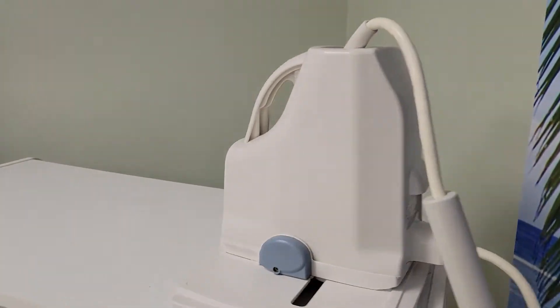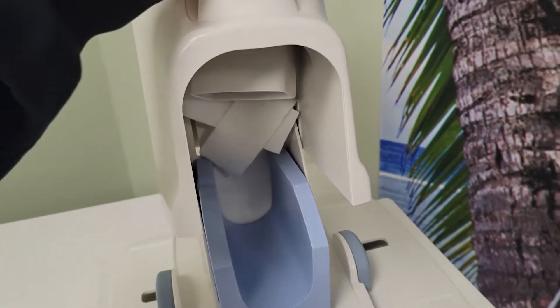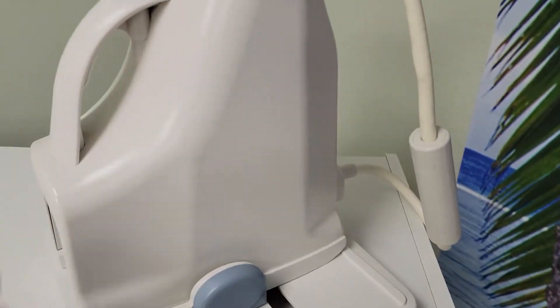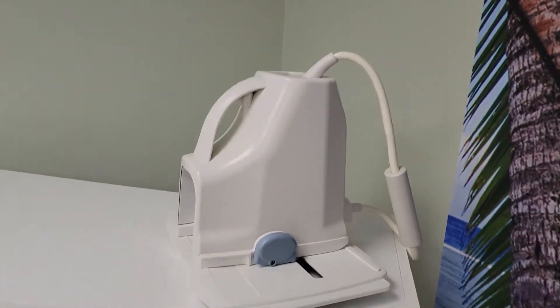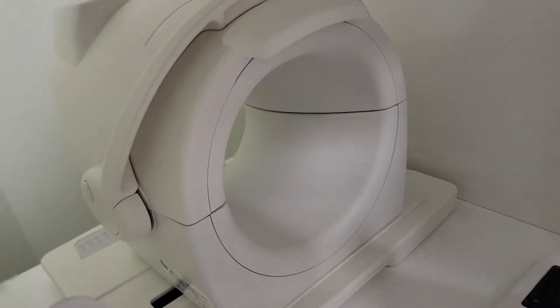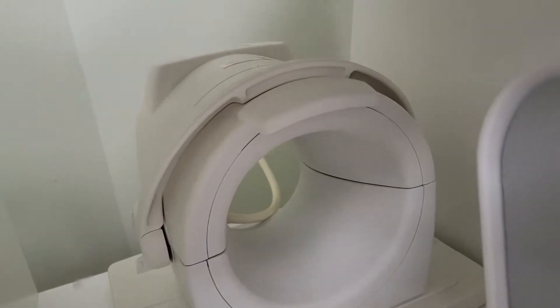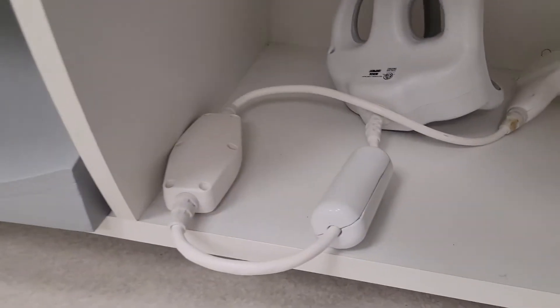The first one you see up here is the foot coil — foot and ankle. And then we have the knee coil back there. You can also do hand, wrist, elbow in there if you wanted to.